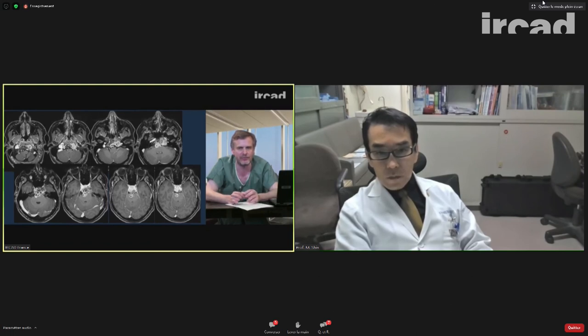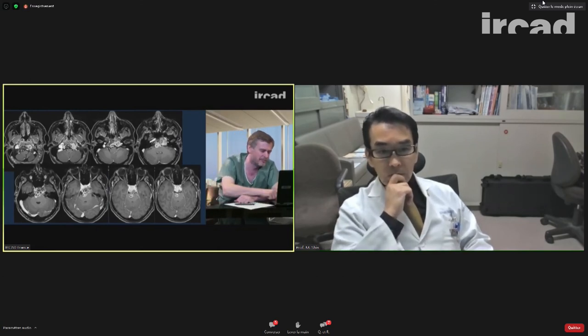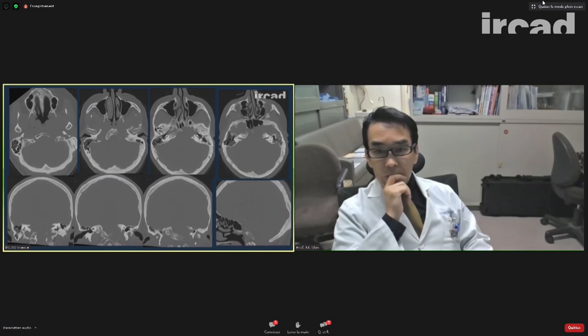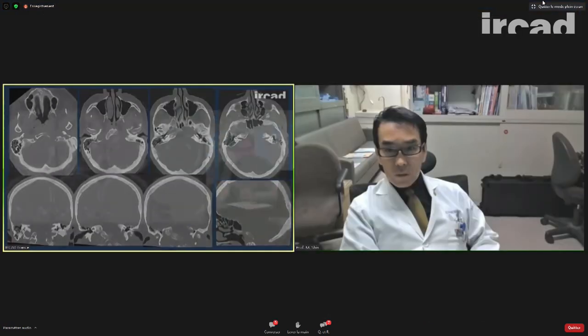It's one of the suspicions that we have. What was against it for me was that it was slow growing: in 2 months, zero difference. We calculated the volume in 2 months. But I agree with you that a biopsy is a good option here. There is also the bone erosion. You see here at the level of the sphenoid sinus, you have this thin shell of bone that remains between the tumor and the lumen of the sphenoid sinus. This, in my opinion, is more in favor of a slow growing process, maybe like chordoma. I don't know if you agree with that. Yeah.